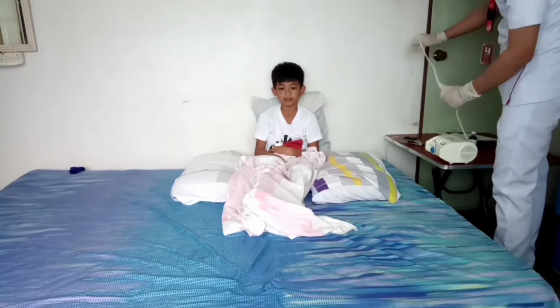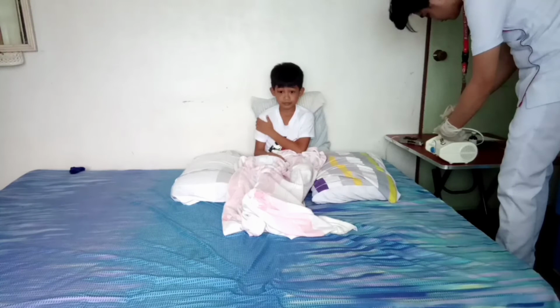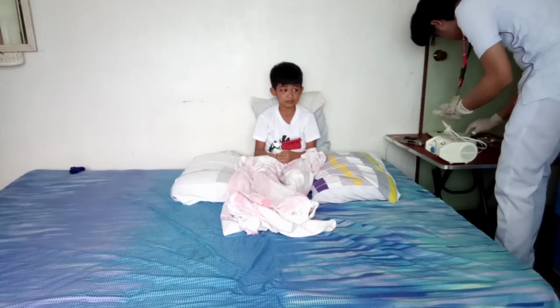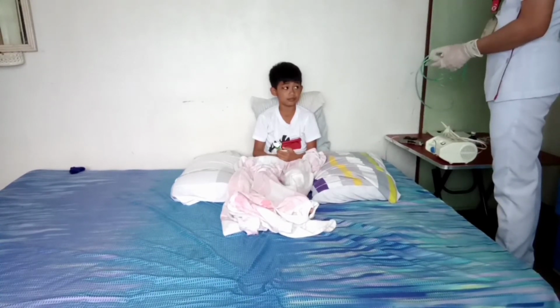And lastly, disassemble and clean the nebulizer after each use. Rinse, dry, and keep the equipment in the patient's room. It is for proper care, reducing the transfer of microorganisms.